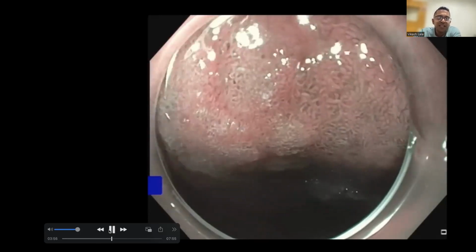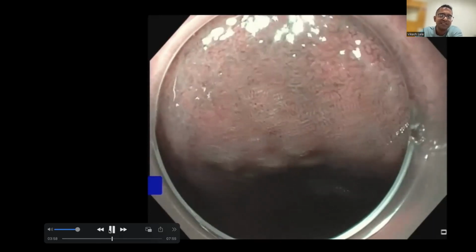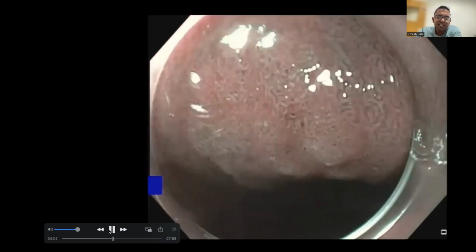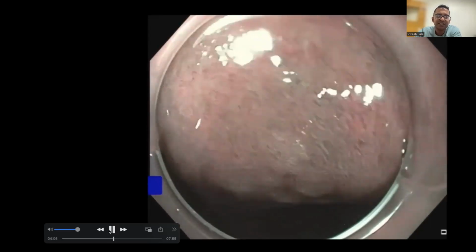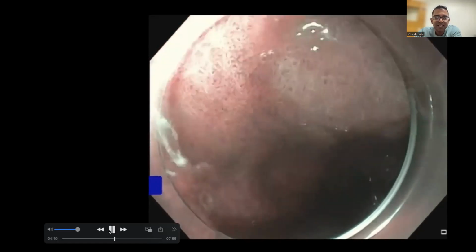And it is very important to identify this because remember in Barrett's, you do not want to burn with RFA. You do not want RFA for visible dysplasia. You always want to resect visible dysplasia. The problem is that bulkiness. When you do RFA, you're not doing full depth treatment. You're just burning the tip. And that is just the tip of the iceberg. So what you will end up doing is creating neosquamous epithelialization. So the squamous tissue is going to grow over it, but the bottom of the iceberg is still there.